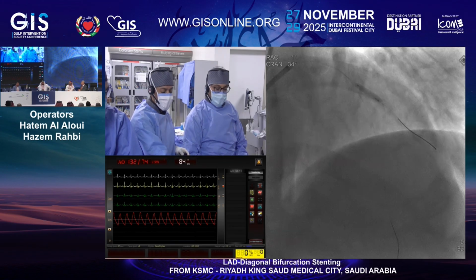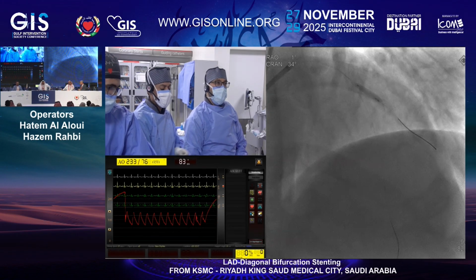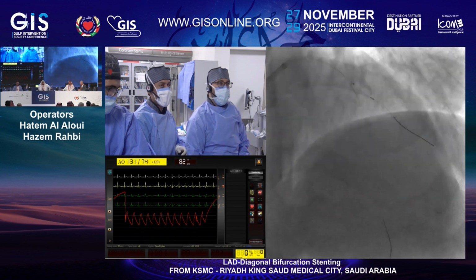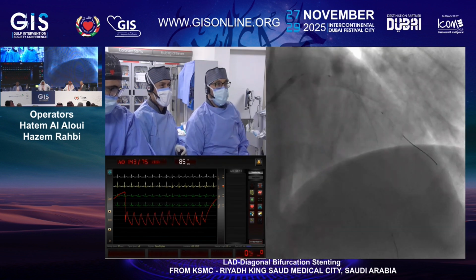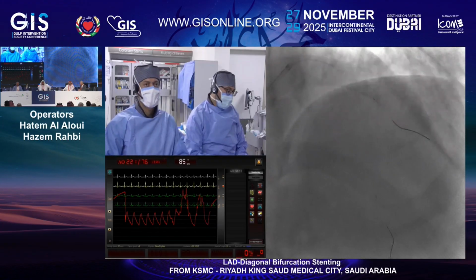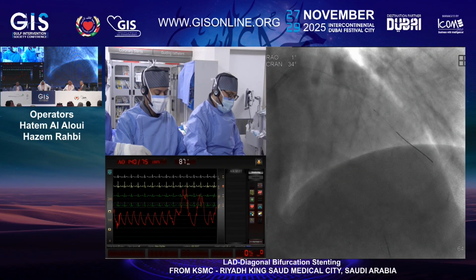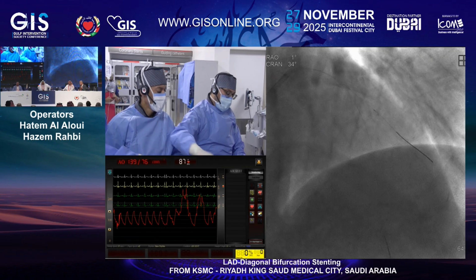Down. So this is a 3.0 by 15 NC, multiple long inflations. We try to cover the whole lesion, but sparing actually the ostium. I think the ostium doesn't need to be traumatized. We'll just apply the drug on it.